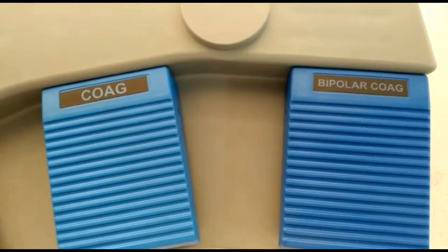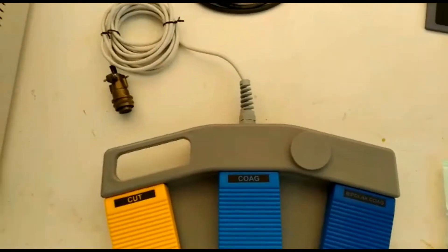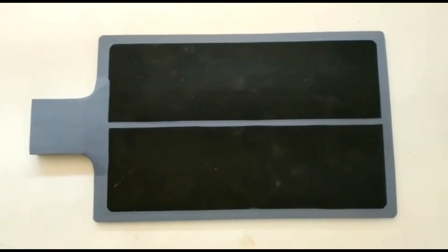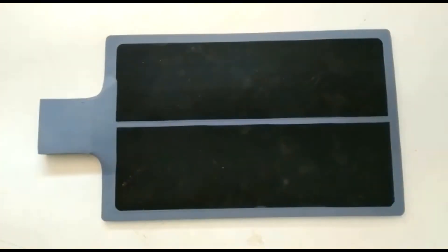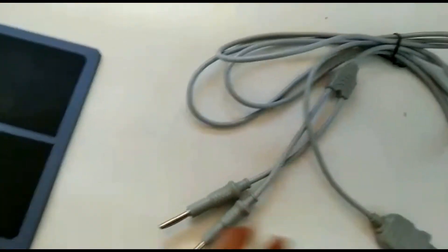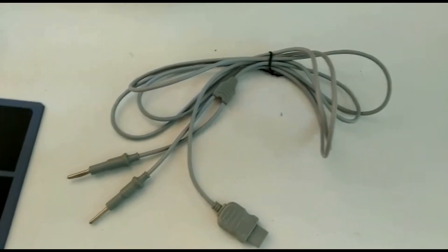The foot switch has three pedals: yellow is typically for monopolar cut, blue is typically for monopolar coagulation, and the third is for bipolar coagulation. All three pedals correspond to the three windows on the machine settings, in the exact same sequence. This is the silicon split patient plate — it has two conductive parts separated by a non-conductive material, allowing an intelligent diathermy to detect whether contact is sufficient. The patient plate cable has two pins on the left that go into the patient plate and the right side goes into the machine.